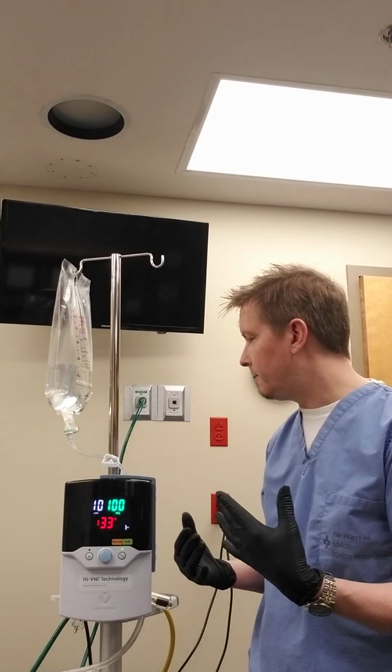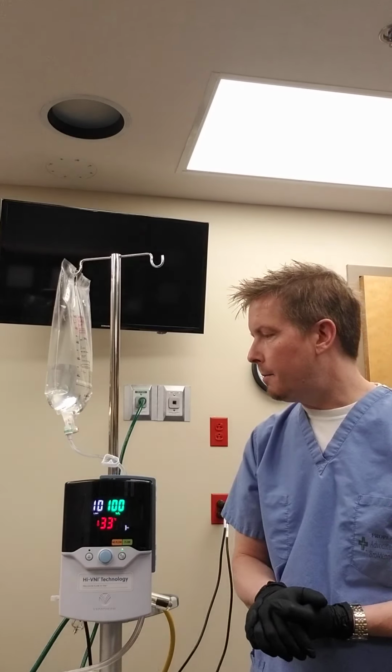So what I'm going to do is go into some of the physiology behind how this thing works. We'll talk about a few numbers, and I'll keep this nice and short and sweet. The difference between oxygen devices and a device like this is that an oxygen device, a mask, a non-rebreather, or even a nasal cannula, just provides an oxygen-enriched environment. You can treat hypoxemia with it, but it isn't actually helping any of the diseases of the lung. And that's where this comes in.